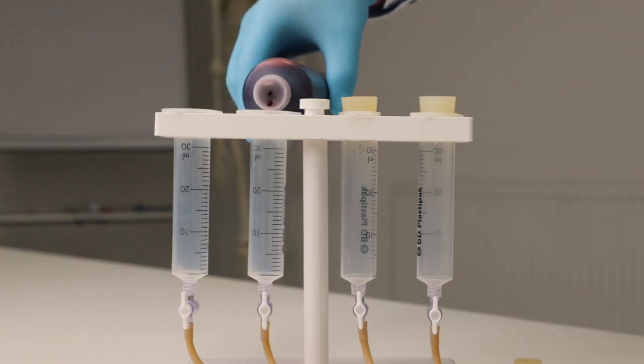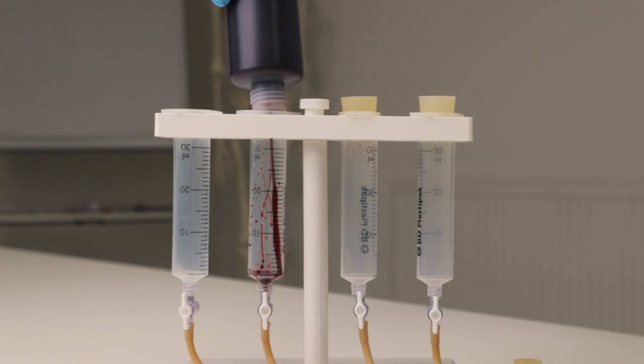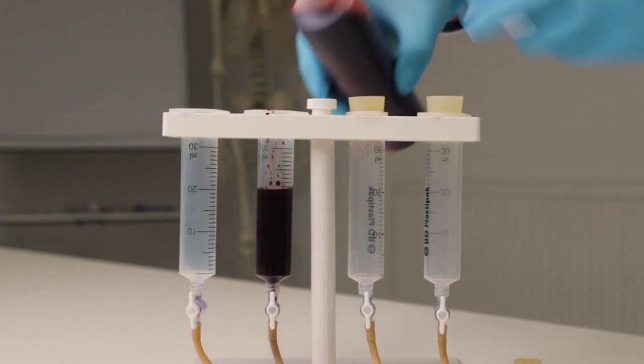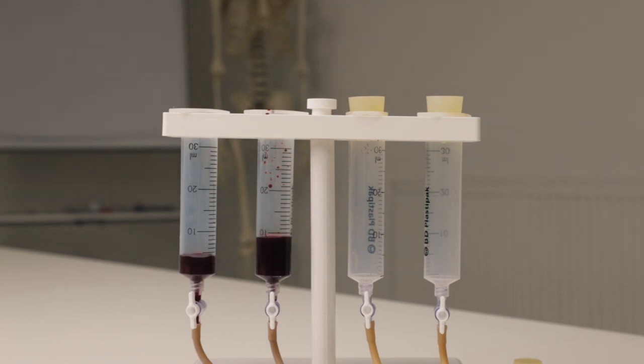Fill blood into one tube. Make sure both stopcocks are open. The level of blood in both tubes will settle automatically due to gravity. The arm is now ready for use.